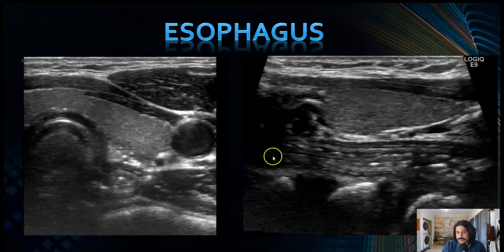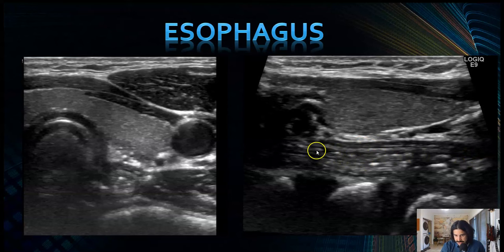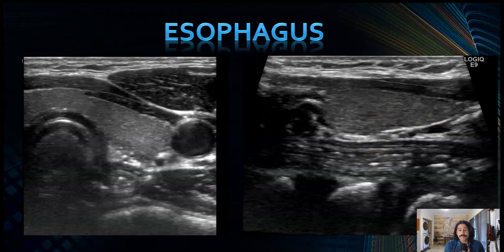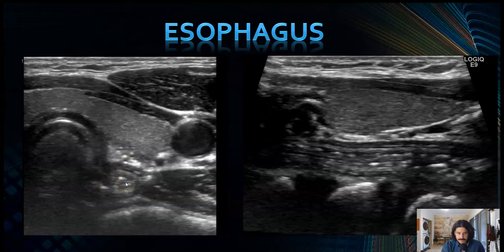In a longitudinal view you can see vertebrae, the esophagus with gut signature, the lumen with air bubbles inside, and then the left lobe of the thyroid. In this view you can ask the patient to swallow and see the saliva and air going down. This is also good to know because when doing a thyroid ultrasound, if you're inexperienced, you may see this and think it's a parathyroid lesion — but no, it's the esophagus.